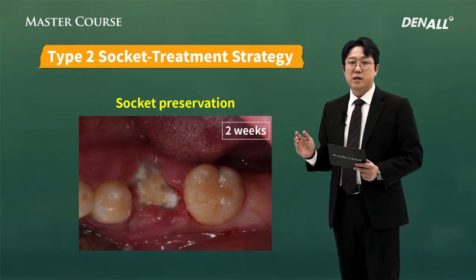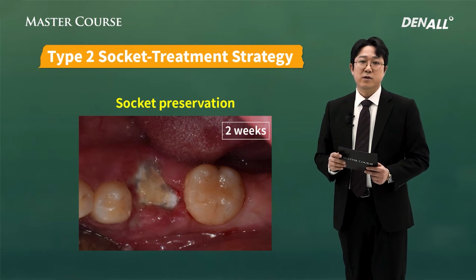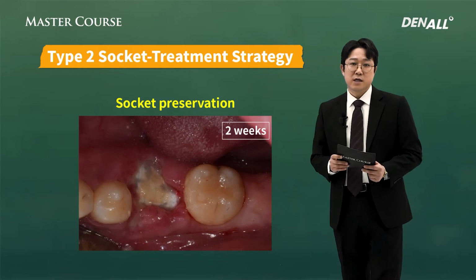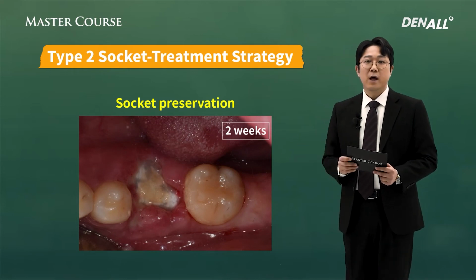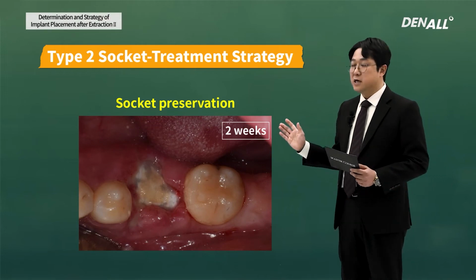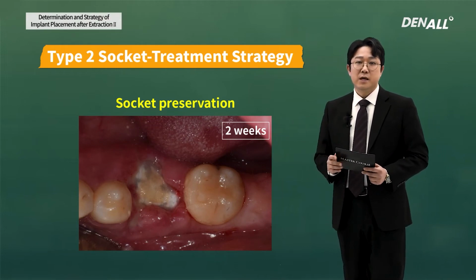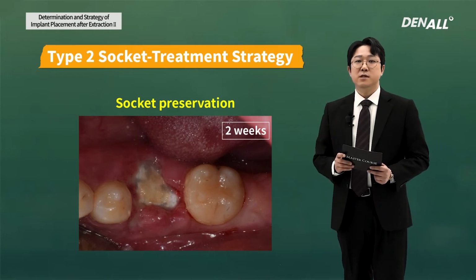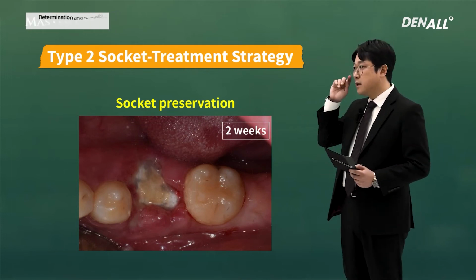And if you plan open membrane technique as you do socket preservation, you need to explain to your patient ahead about what could happen, and the patient needs to understand fully that the membrane can be exposed. You need to make the patient understand that this is not a problem.